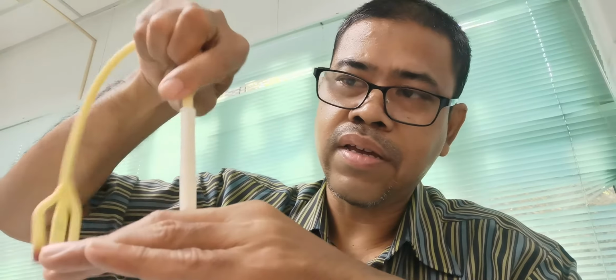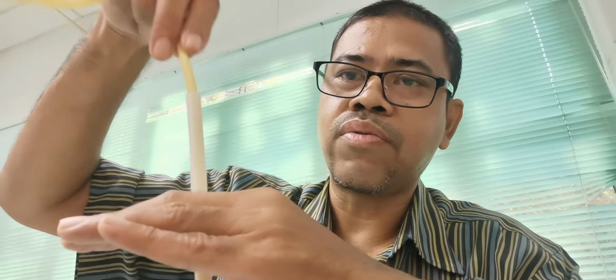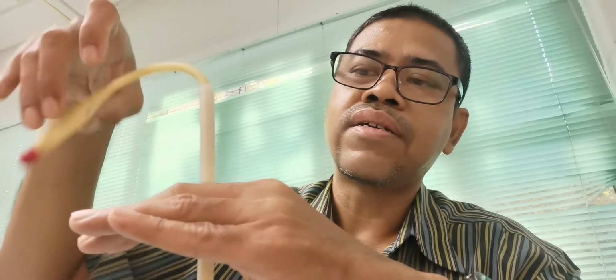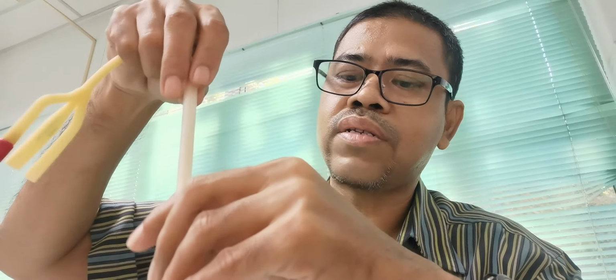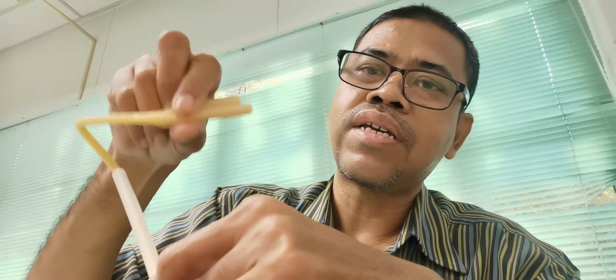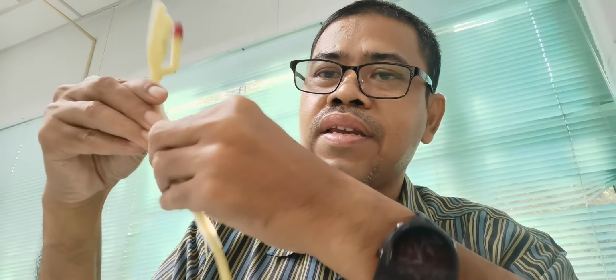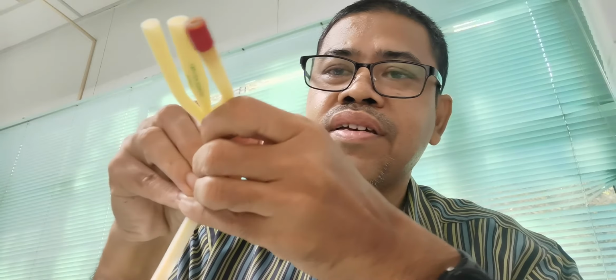Once you withdraw this trocar, pass the catheter all the way, size 16 and below, even size 18. So you pass it all the way, and once the urine comes out through this tube, only then do you withdraw the sheath, and then you can break it. This plastic end is very elastic, you can break it.